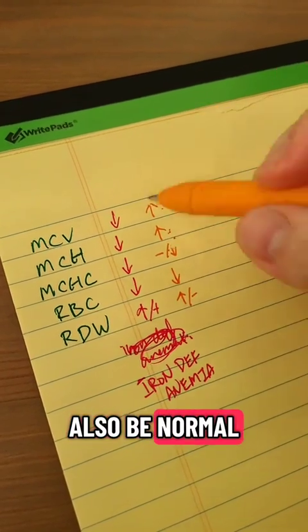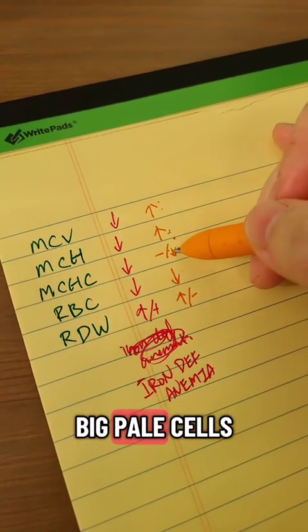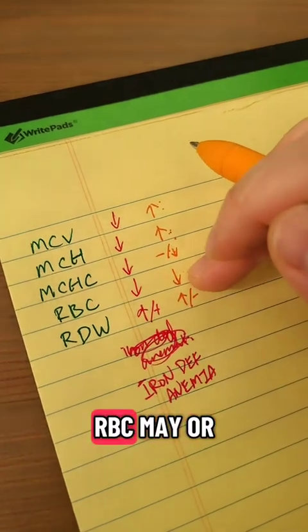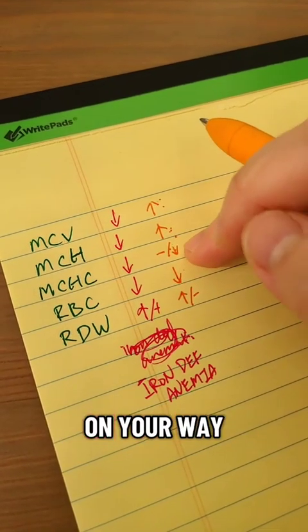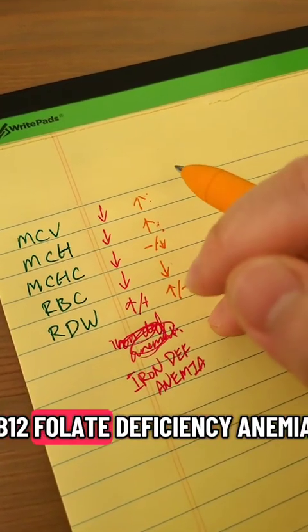And this is compared to if your MCV is high, your MCH might also be high. This might also be normal, with MCHC being a little bit lower. So if you have big pale cells, again, RBC may or may not be normal if you're on your way to this type of anemia. This is more of a classic B12 folate deficiency anemia.